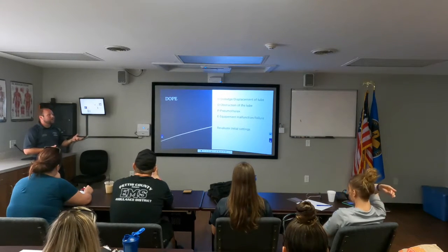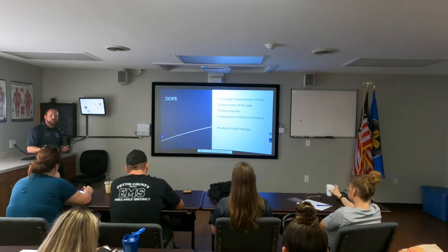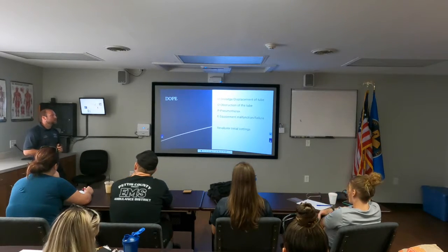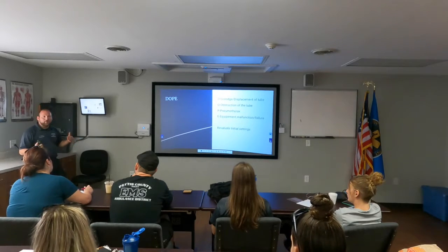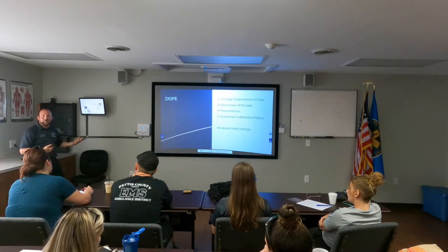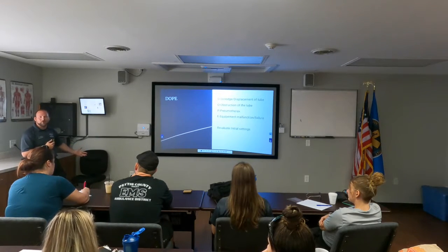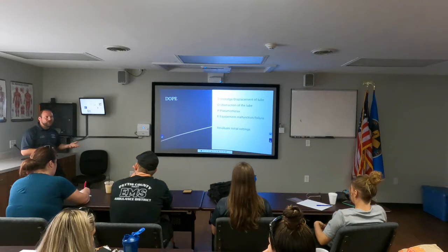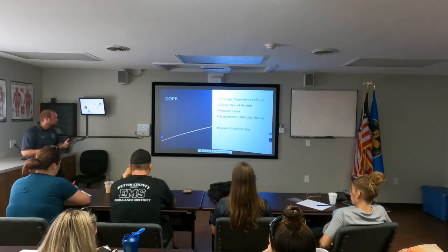Again, always reevaluate your initial settings. Look at what their settings are. Does it match, one, your patient's conditions, and two, their physical presentation? If you have somebody who is 6 foot, but with a tidal volume of 300, is that going to be appropriate for that individual? No, that is way too low of a tidal volume. We want to base it upon their ideal body weight and start moving that up. We're actually looking closer around 500, 520 if I remember correctly, as where you want to start with that.